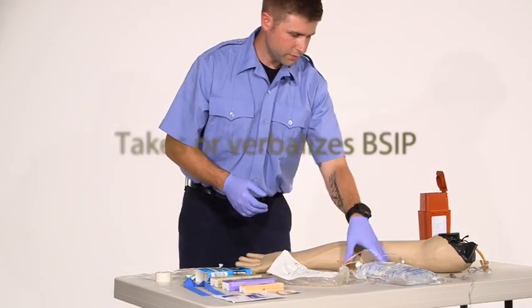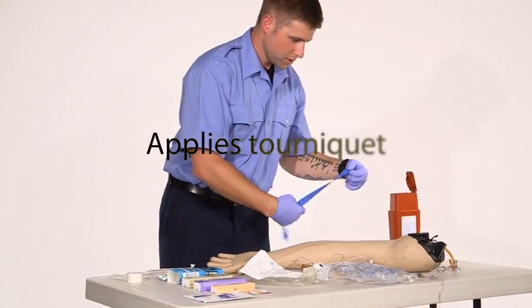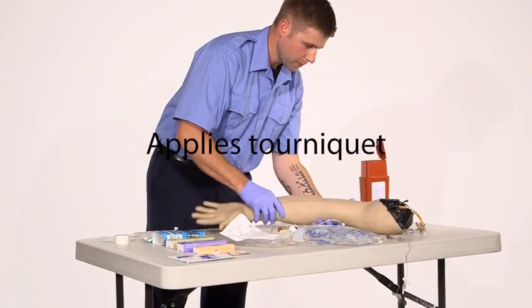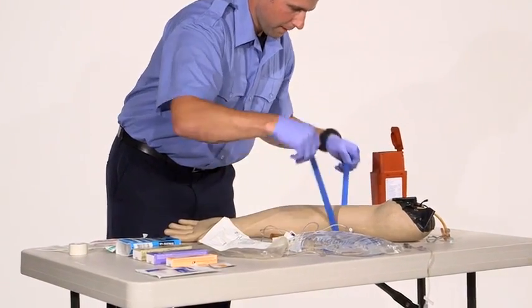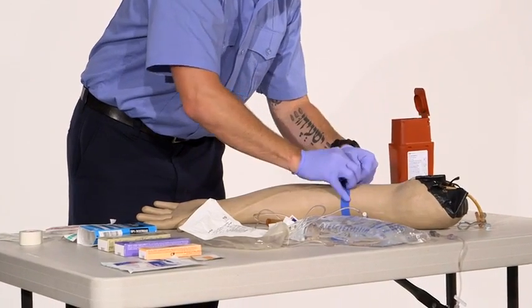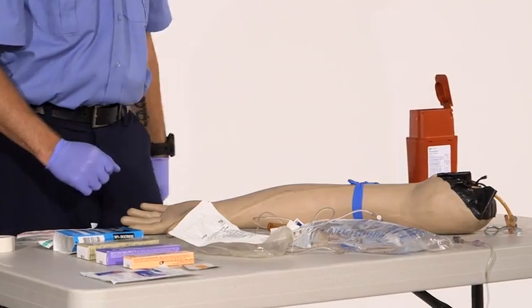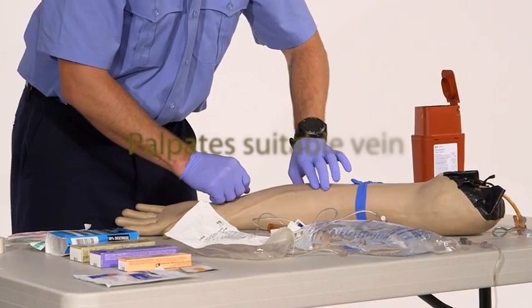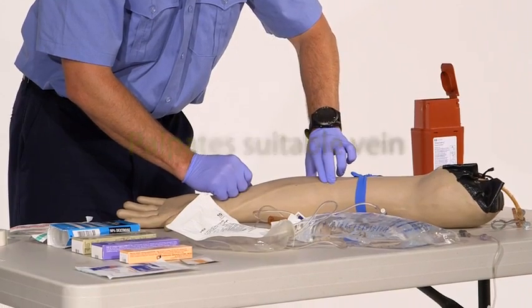All right, I want to select a vein, so I'm going to place a tourniquet on the arm. I've got my tourniquet placed. I'm going to palpate a vein, find a correct site for the catheter.